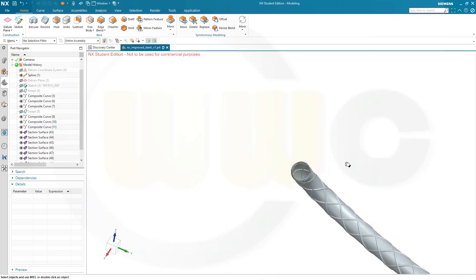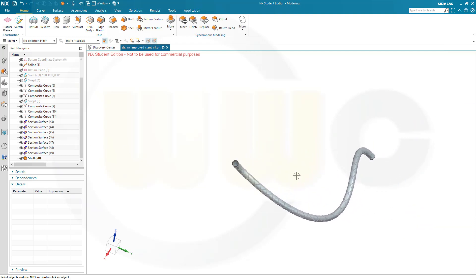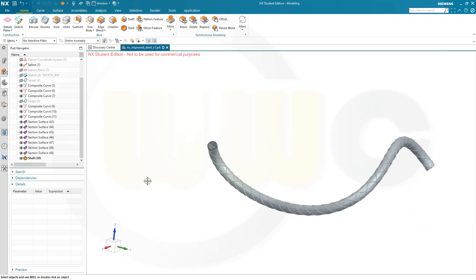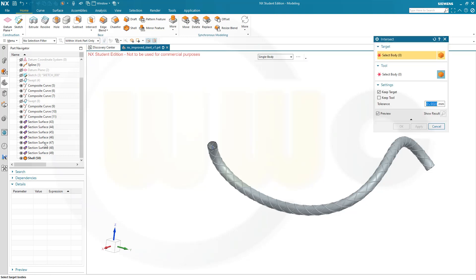Now I want to intersect that last section surface with those six before. And I do it separately and then unite those solids, because the other way around I always got an error message. So let's go for Intersect.